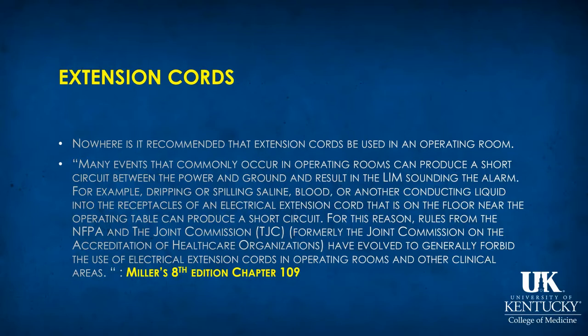And this is explained in Miller's 8th edition, and it's summarized that rules from the National Fire Protection Association and the Joint Commission have evolved to generally forbid the use of electrical extension cords in operating rooms and other clinical areas. So using common sense and some organization in your operating room, you should make all efforts to eliminate extension cords in your workspace.